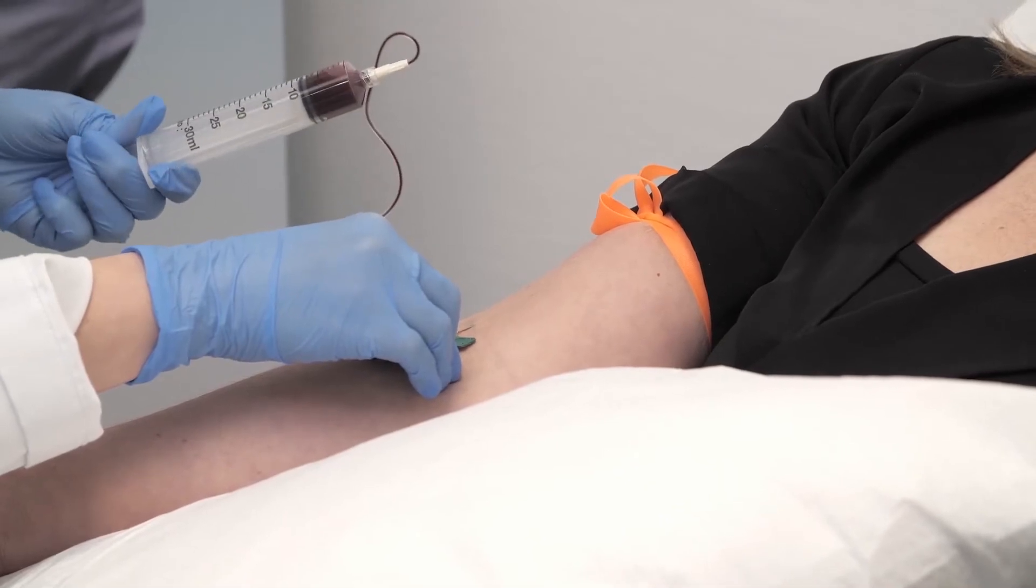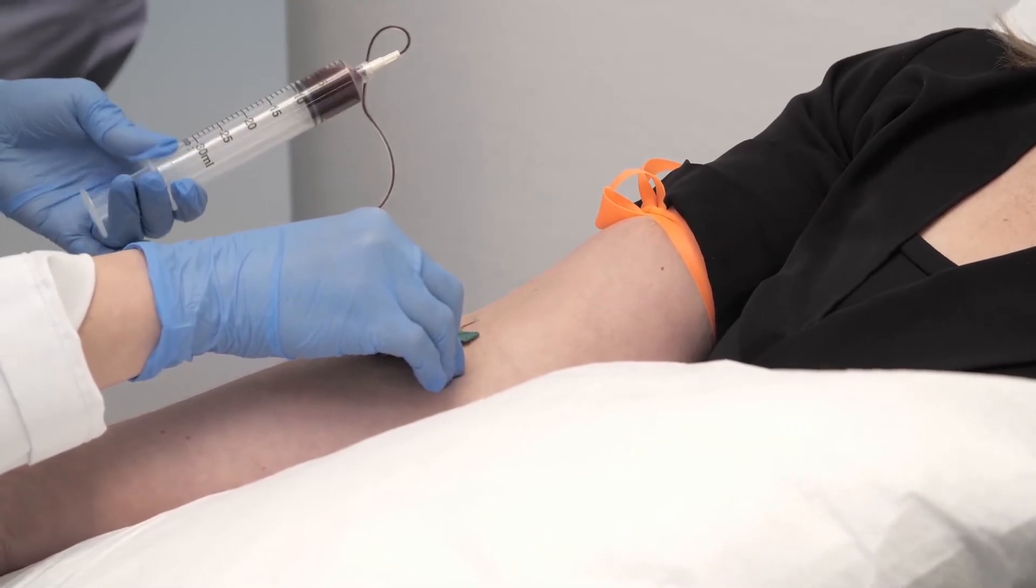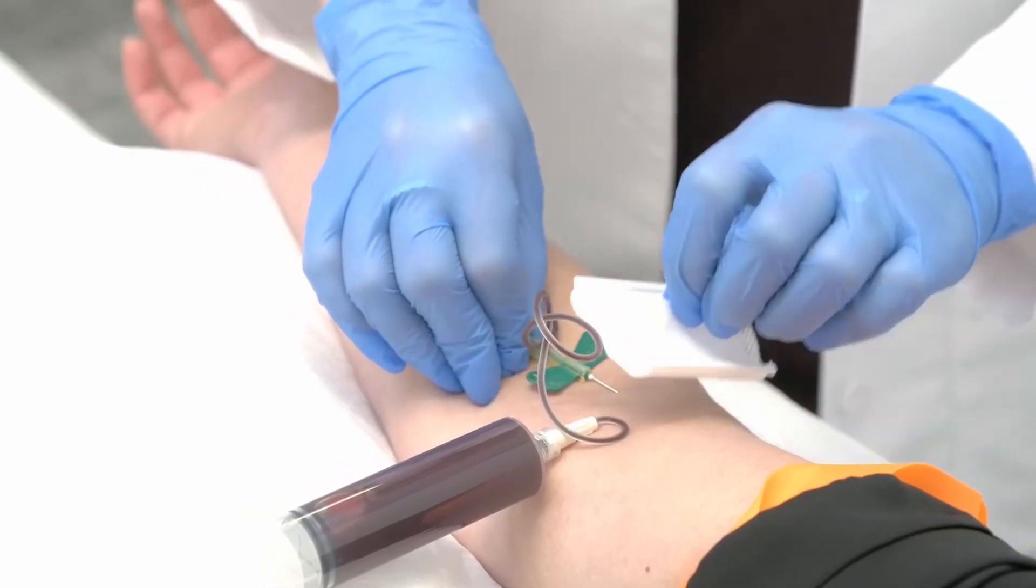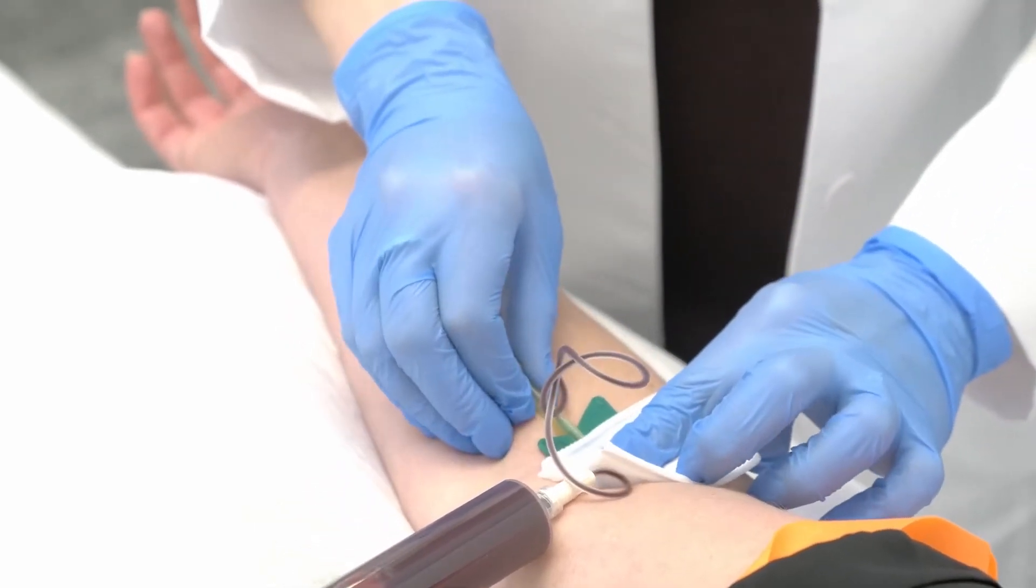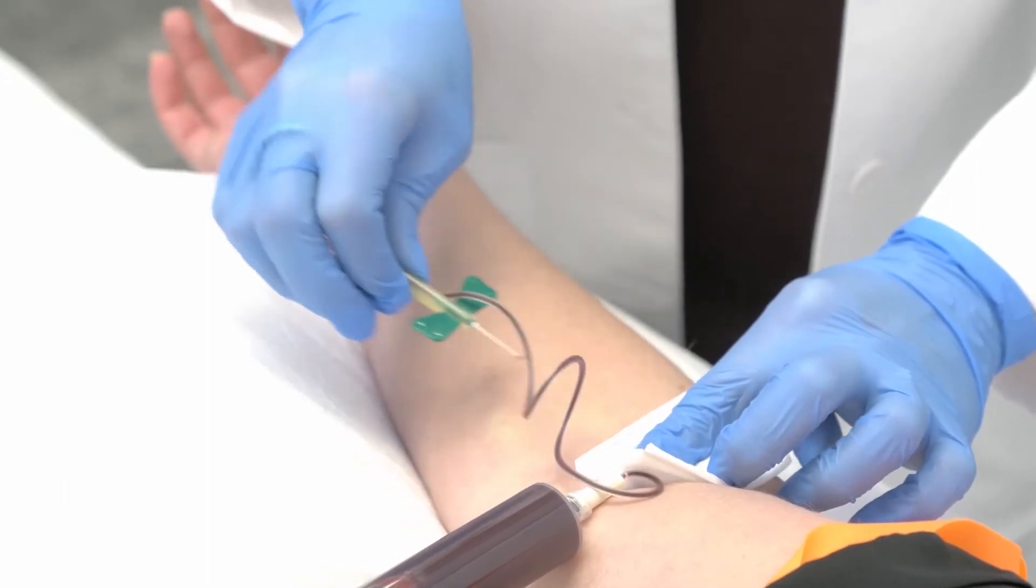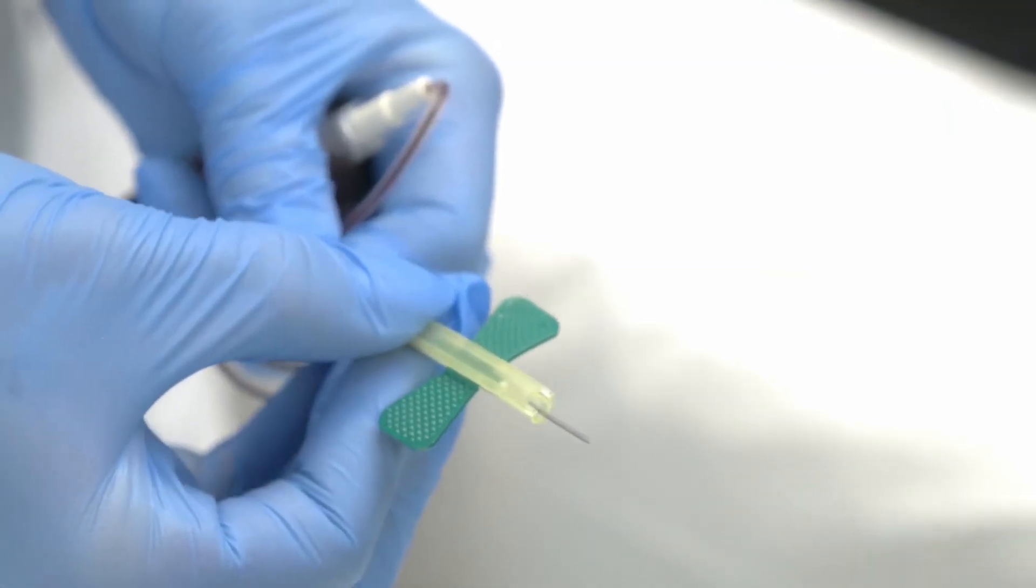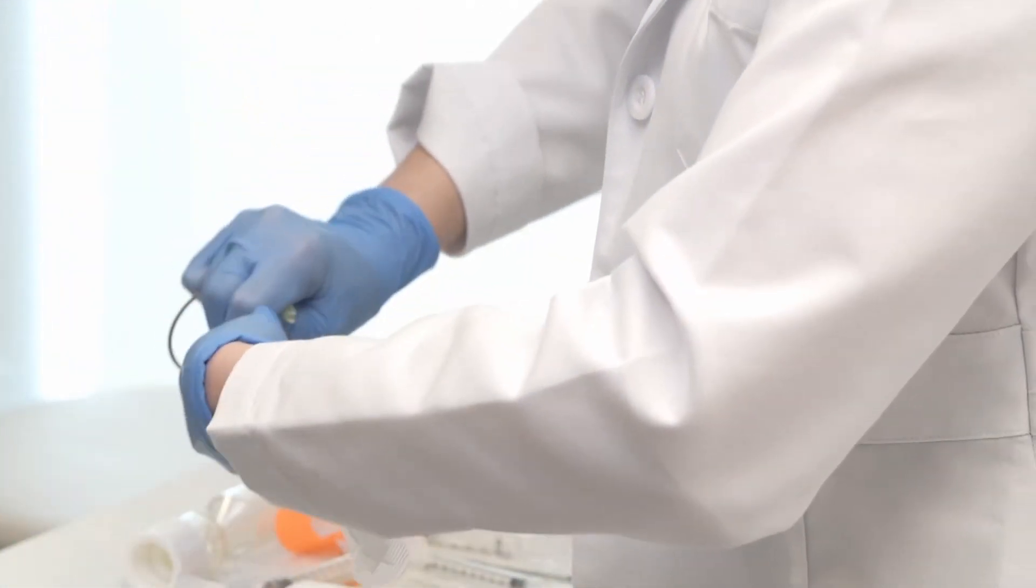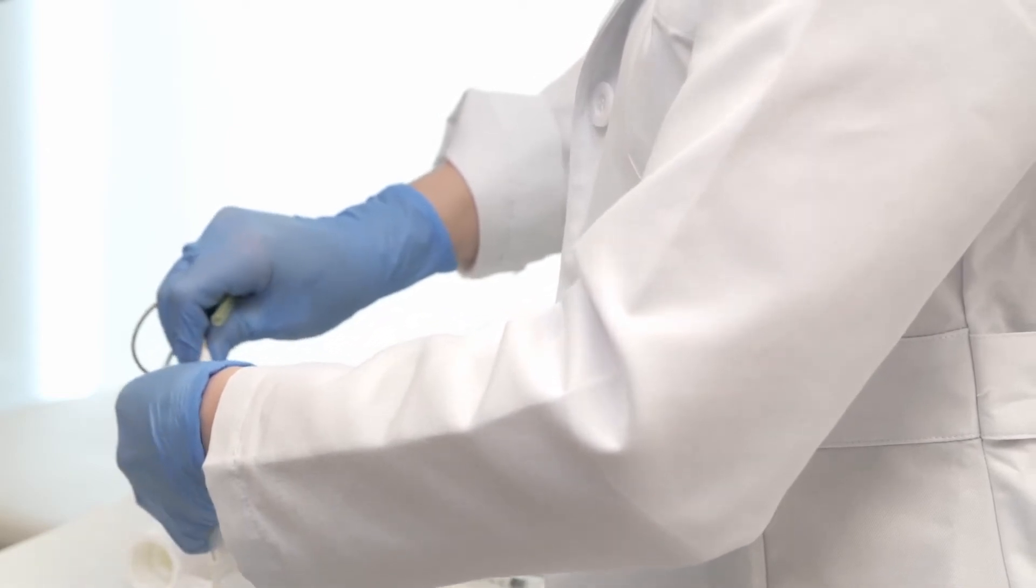Slowly draw 23 ml of blood into the 30 ml syringe that has the 2 ml of sodium citrate. Remove the butterfly and apply a band-aid or cotton with micropore tape to the puncture. Slide the protective yellow cover to shield the needle for safe disposal. Remove the butterfly from the 30 ml syringe and discard all biological matter as per regulation.